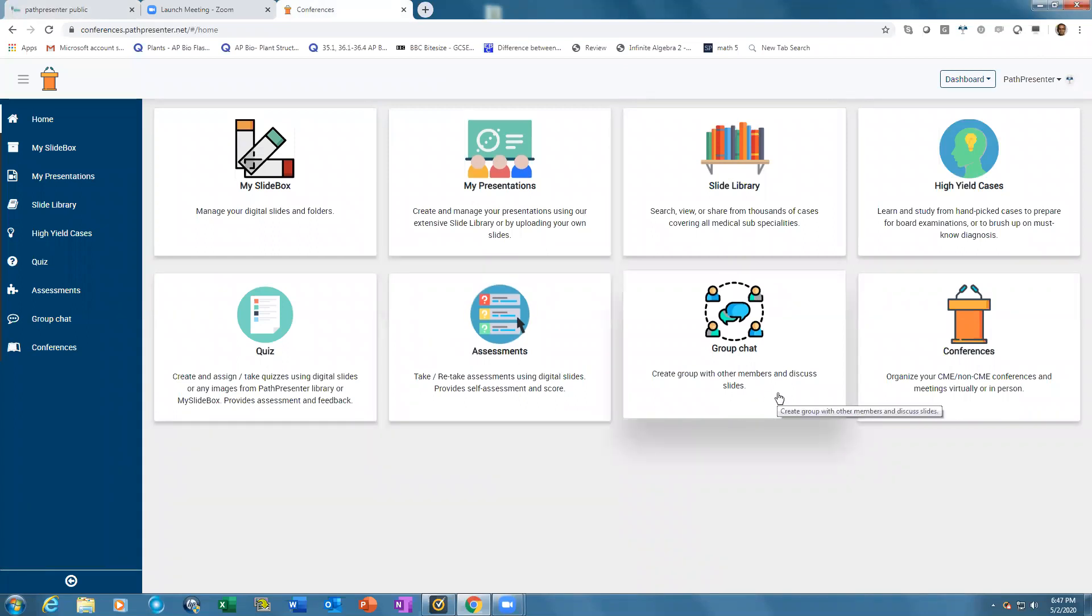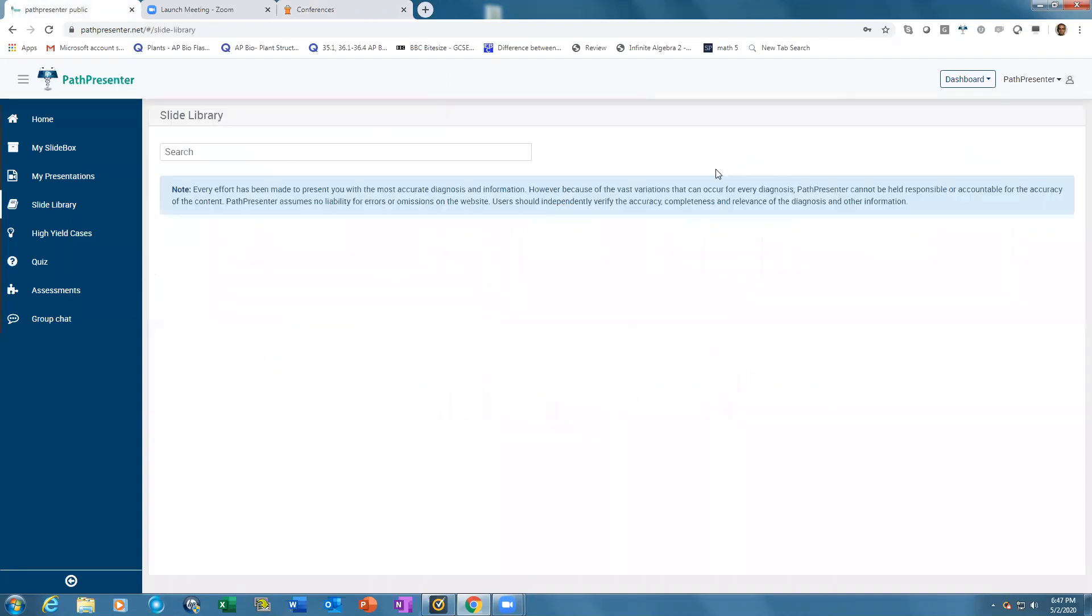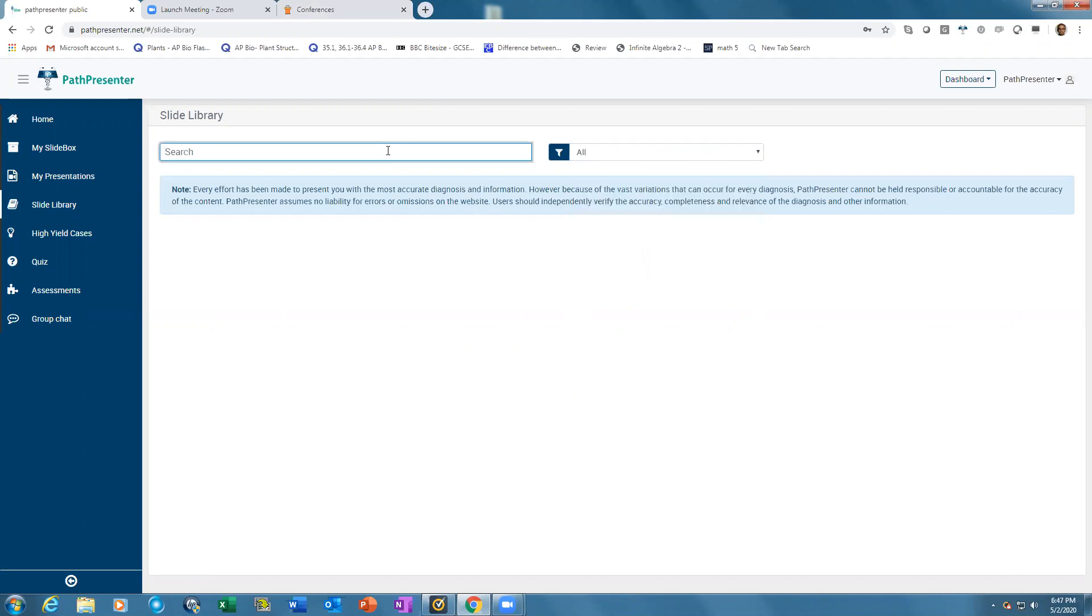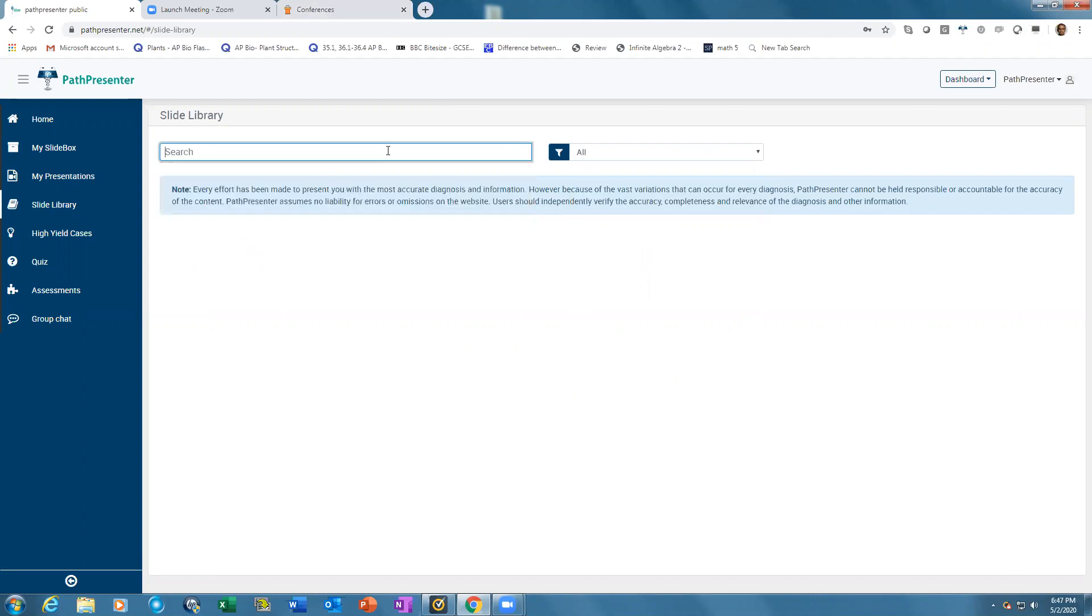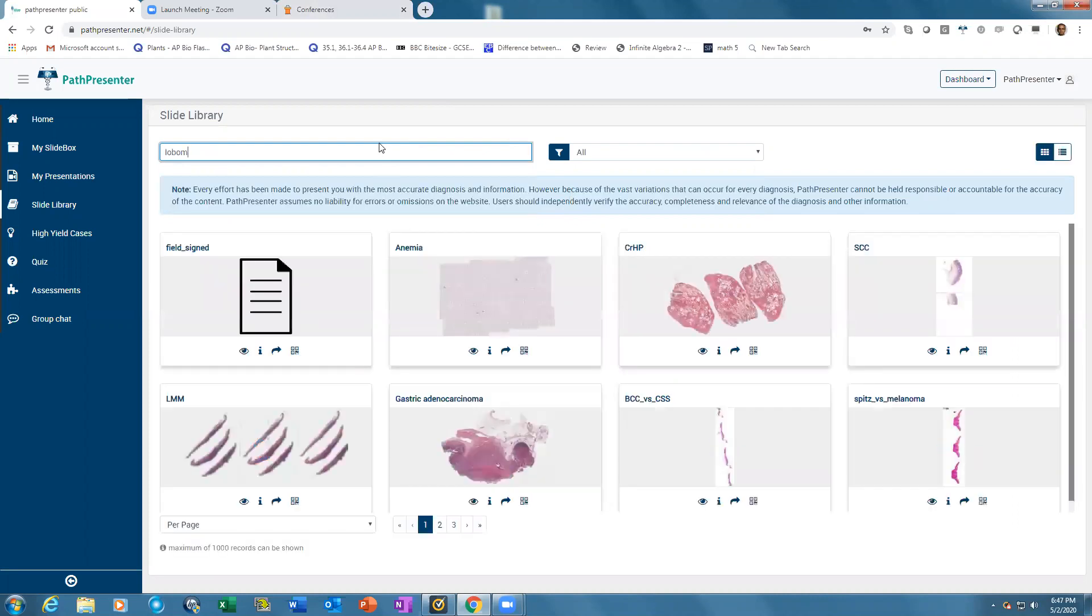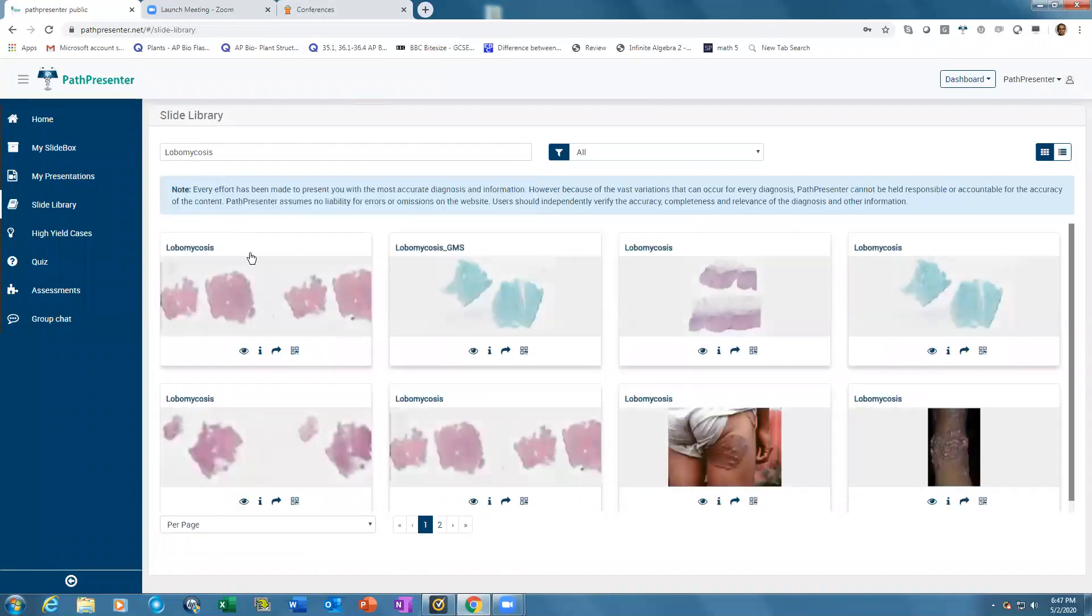The slide library provides access to thousands of digital slides divided into specialties. You can type in any diagnosis to find a specific slide. Once you type in the diagnosis, it will find multiple slides for that entity.